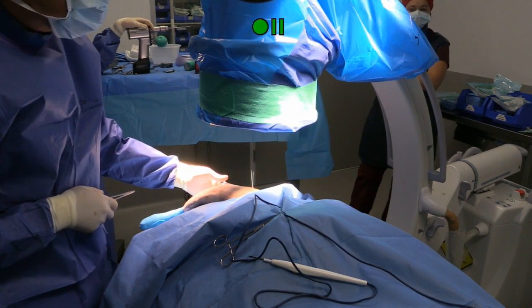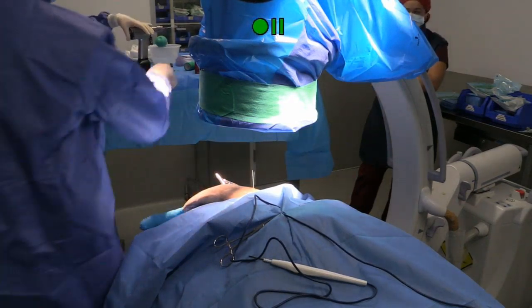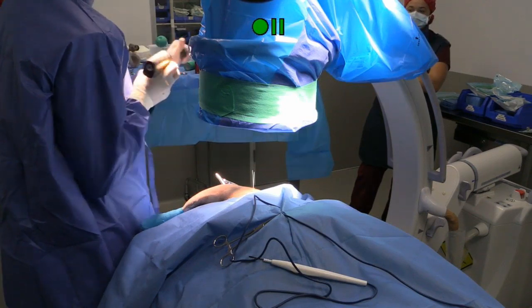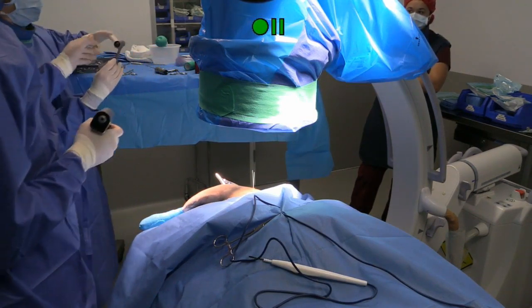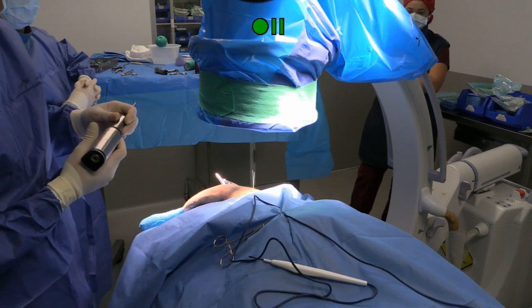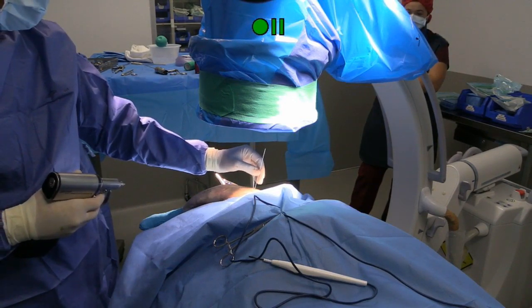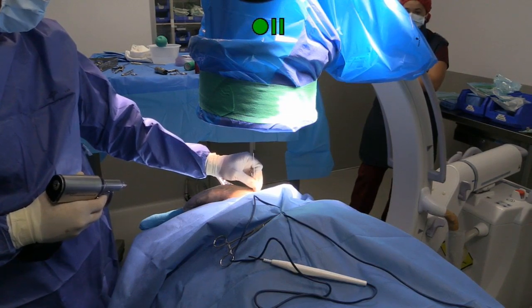So now we're using a cannulated drill bit, which has a hole in the center of the drill bit, and you actually feed the drill bit over the wire, and that guides it exactly where you want it.